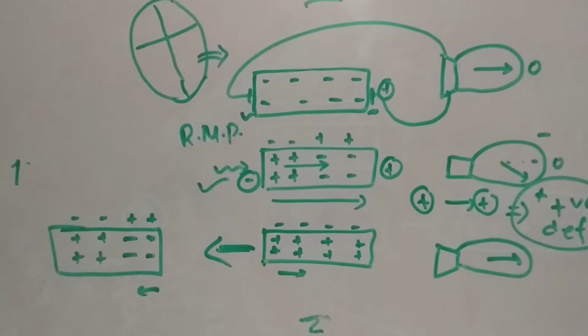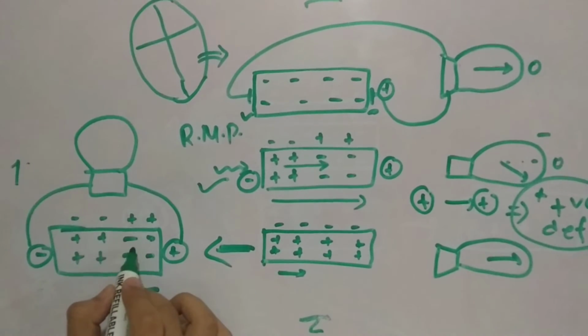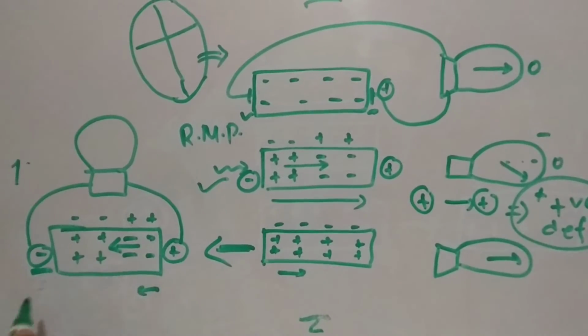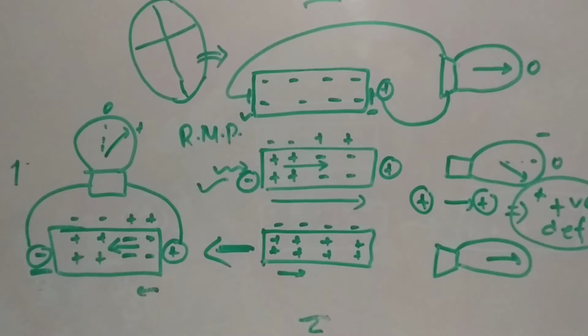We have our exploring electrode here, and this is our negative electrode. When we connect this to our galvanometer, the resultant negative vector is going towards the negative electrode. So negative going towards negative will also give you a positive deflection. This will be a positive deflection if this is 0. This much you have to understand in this phase.